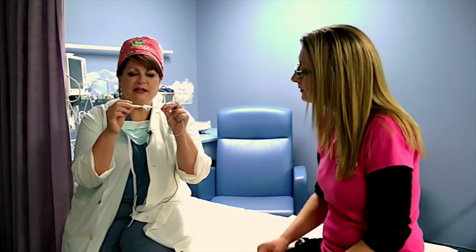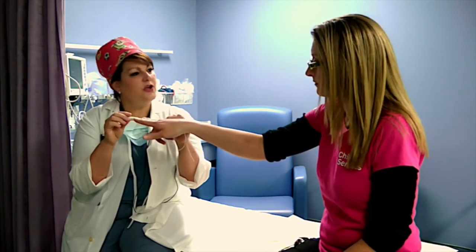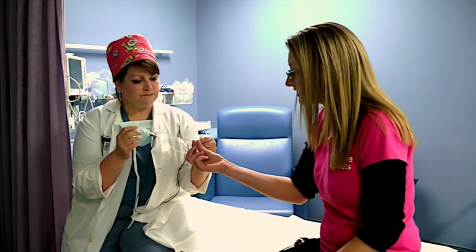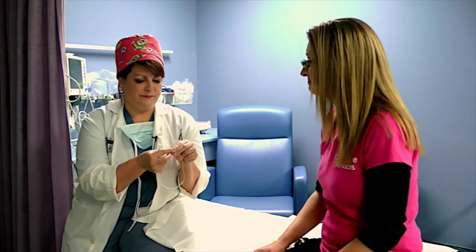Wow. So this is what a PICC line looks like. Does it hurt when they draw blood or give medicine? That's one of the best things about the PICC lines, is you're unaware when any of the medications are going in, and you don't feel it when any of the blood tests are done. So it cuts down on many, many pokes. And it seems like it's thinner than a piece of spaghetti. It is. It's very, very tiny, and it's small enough to fit inside your veins, inside your bloodstream.